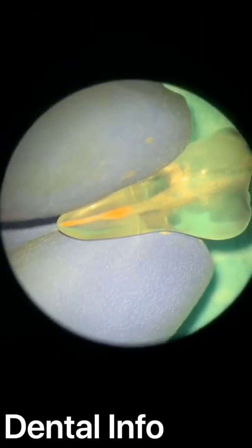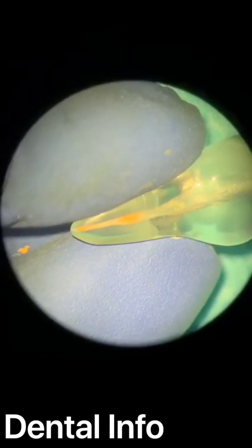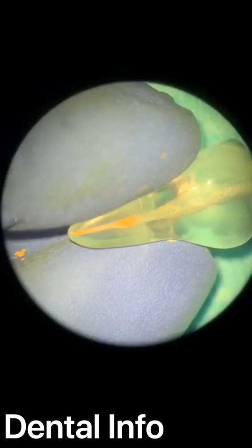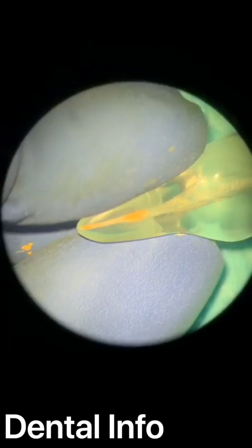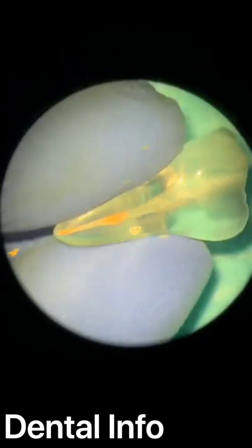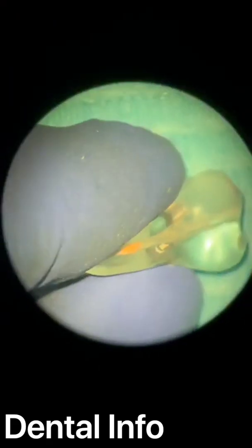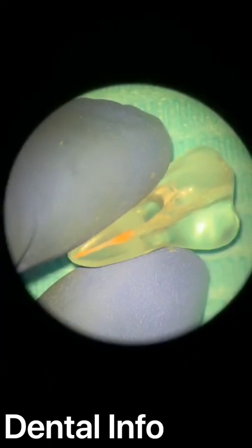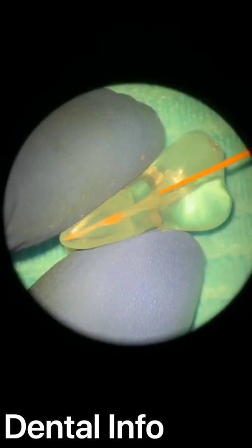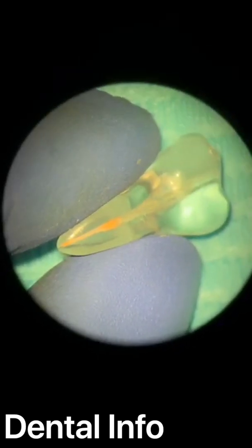Okay, now after that I want to fill back my canal, or the tooth canal, with warm gutta percha. But before that, you have two choices. Some people recommend you to put sealer here, and some people no. They go directly and they are filling the canal without putting any sealer. But for me, I always like to put some sealer inside the canal to make sure that my warm gutta percha will adhere to the walls here.